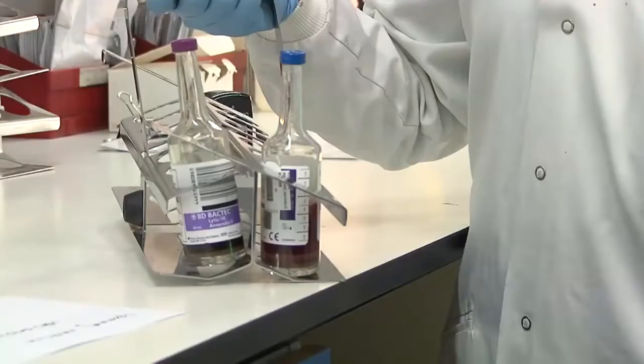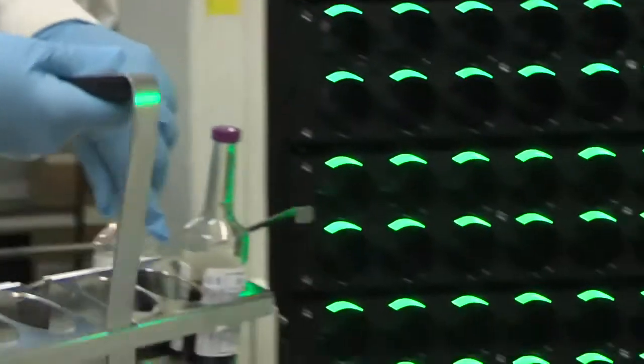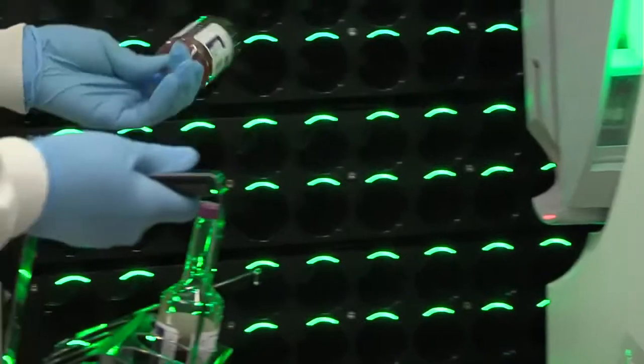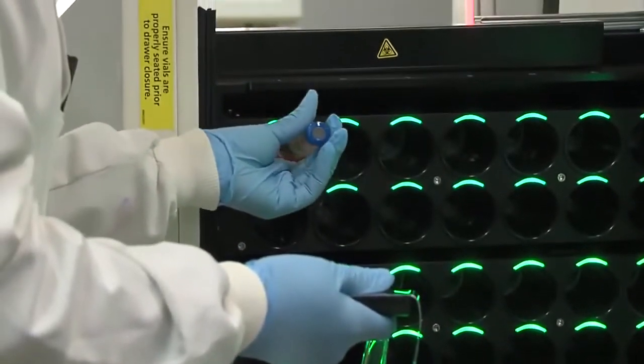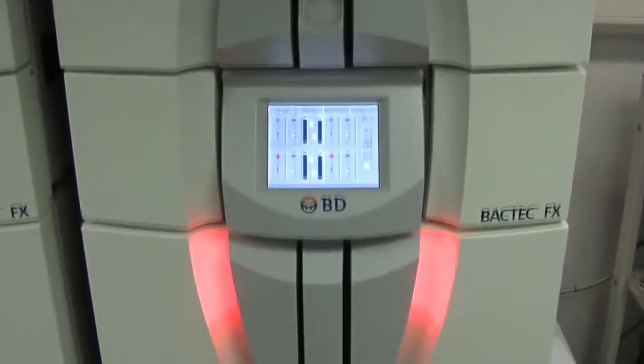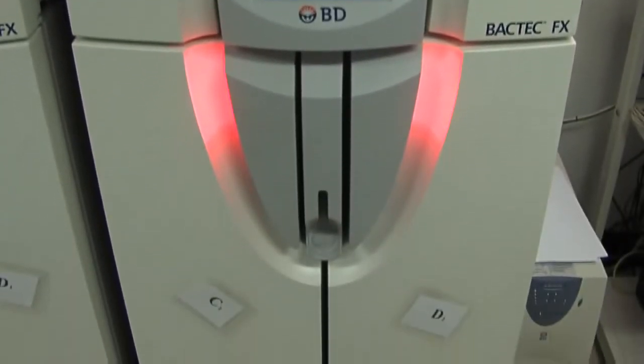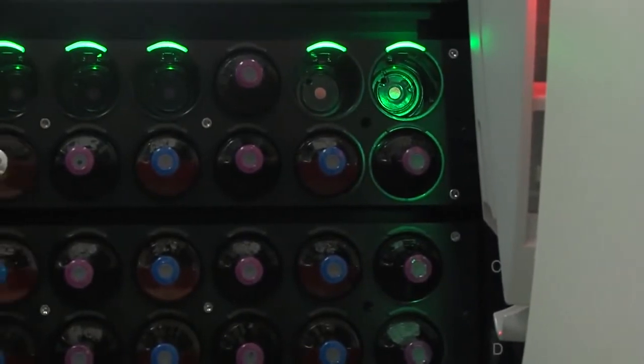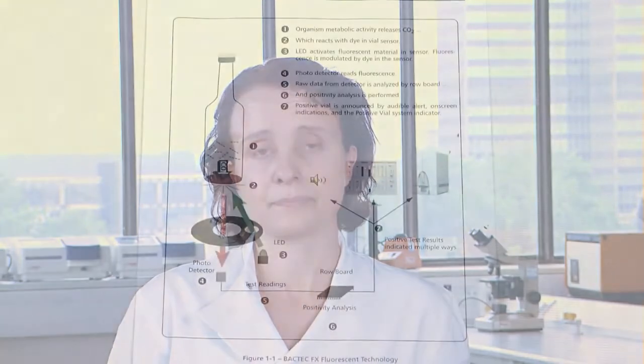On taking the blood culture, the sample should be immediately transported to the laboratory, and on arrival, it is barcoded onto the blood culture analyzer. The analyzer is an integrated piece of equipment consisting of an incubator at 35 degrees to allow optimum bacterial growth, an agitator, the bottle racks rock continuously, and a growth detector system inbuilt into it. Blood culture bottles are loaded onto the analyzer and incubated for up to 5 days.